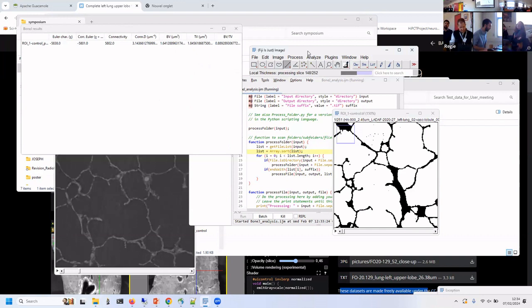So yeah, my computer is not very powerful, so it takes a bit of time. But it's a quick analysis that you could do if you would like to assess. Here I just show you the control area, but we also have a diseased area. In a lung, for example, in some places you have a diseased area, and some places look quite healthy. If you want to assess the discrepancy between the different areas, you can use this tool to check.